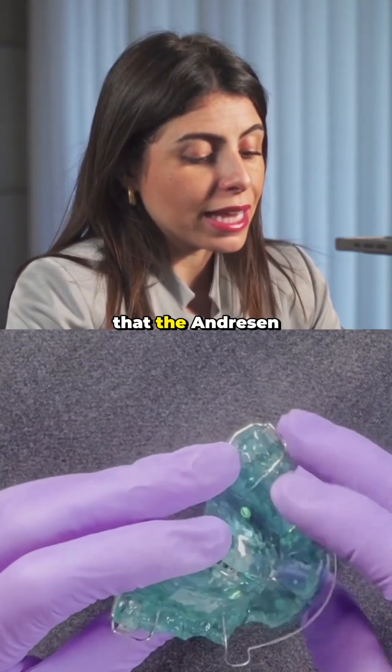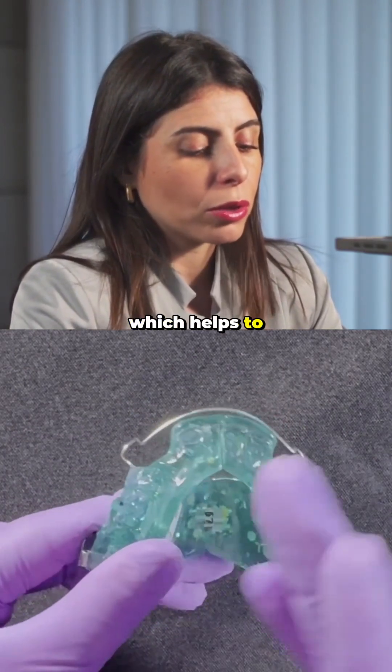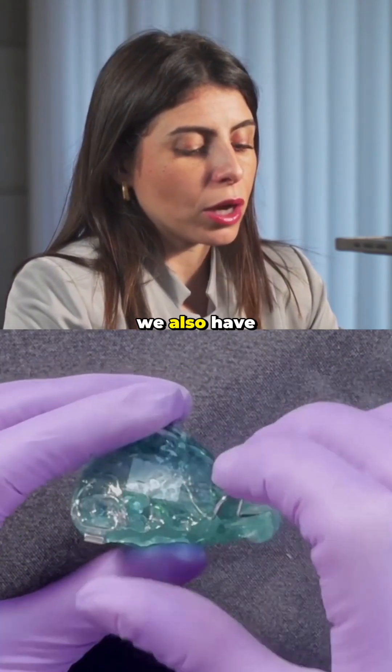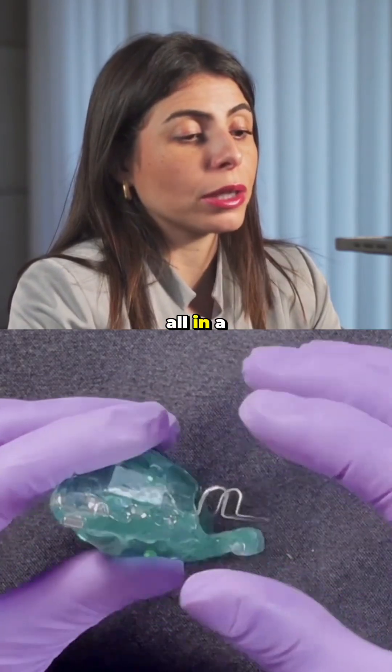It is important that the Andresen Activator also includes an expansion screw, which helps to achieve expansion within both the lower and upper arch. We also have acrylic that can be worn down to correct the overbite — all within a single appliance.